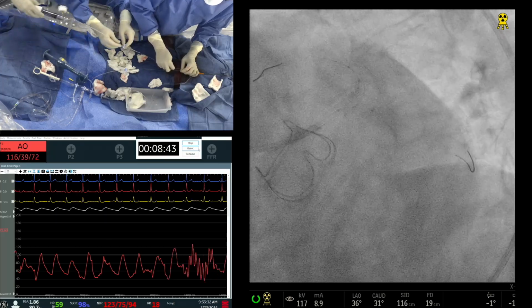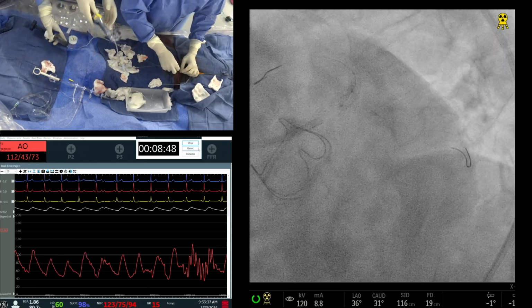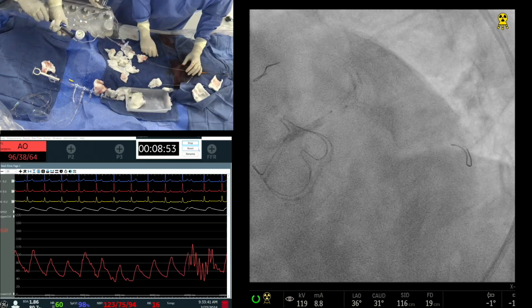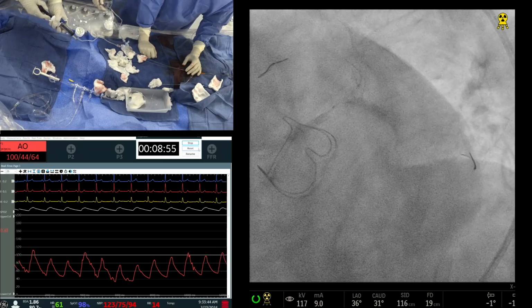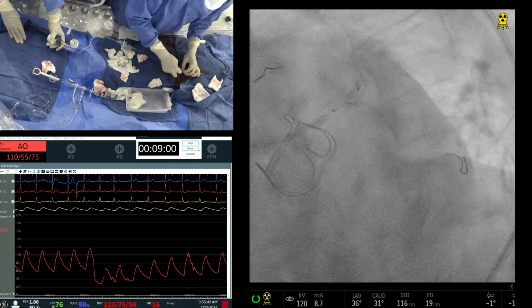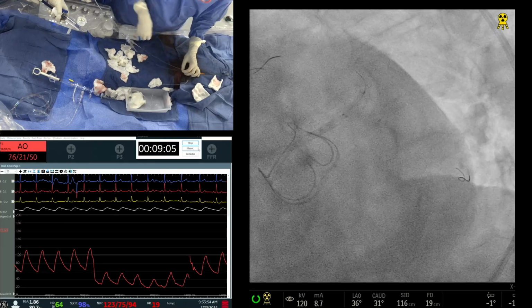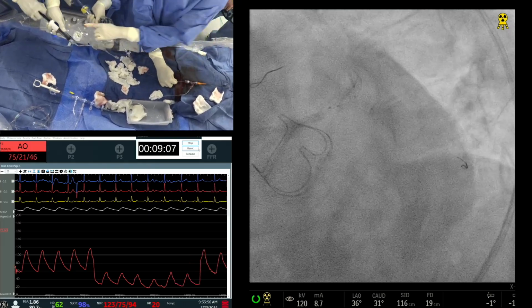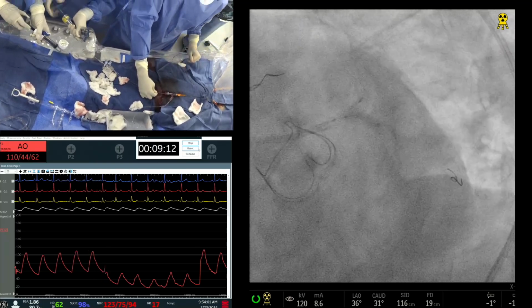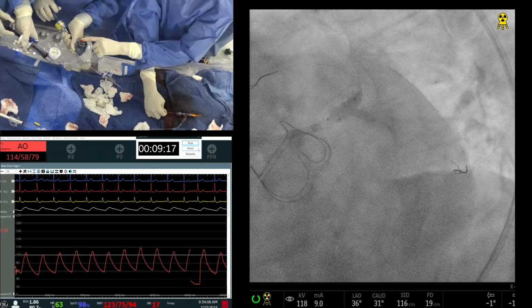Good. So yes. This is our 3.0, which was the plan. Let's bring the other one back. That's a 3.5. So now question is, a lot of people do a report and all this. I think once you do a kissing, it's okay. You've done a kissing. You already had done the POT. The logic behind the POT, our paper just coming out in the JACC Interventions, is that the POT is done without much scientific data. Everybody has POT, but there is no data to support.